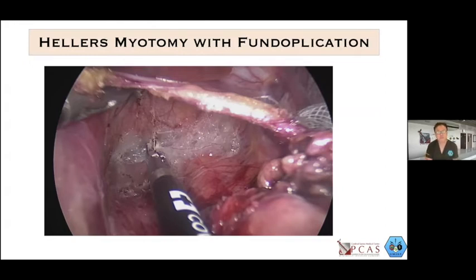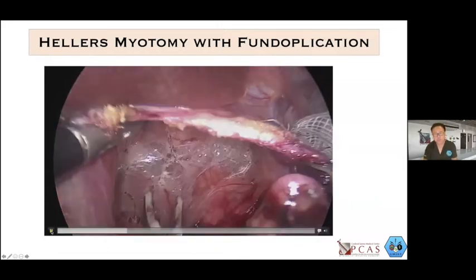Although a 45-degree telescope takes a lot of time to be comfortable using, in the same manner you need to practice how you would use your 30-degree telescope. But you have to look at this one. You're actually looking straight through that hiatal area, unlike if your placement of that optical trocar is way on the midline, where trying to look at that hiatal area would be quite difficult. So you need to set the stage to be able to have a good dissection, a good exposure of whatever area you would want in that upper region.